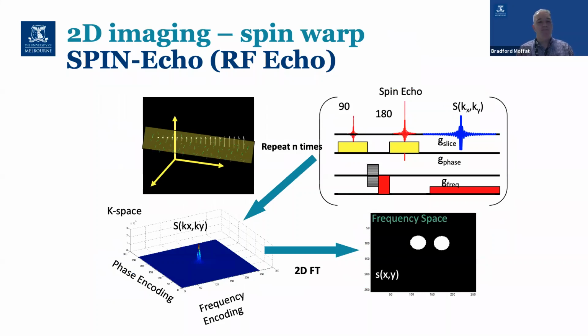And in the magnetic resonance experiment, we combine, as I indicated earlier, several different types of magnetic fields to get an image. And we play these magnetic fields out in kind of like music scripts. We play them out in what we call pulse sequences. And we often refer to the MRI scanner as an instrument, and it is basically that. It is a very expensive electrical musical instrument, if you like, but instead of music coming out, we get beautiful images of human biology.